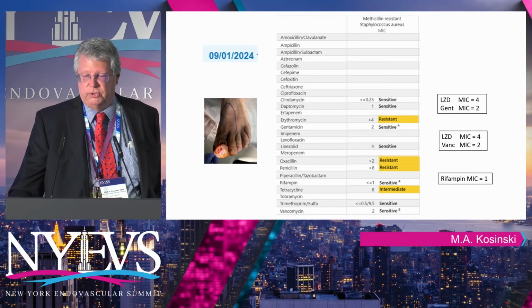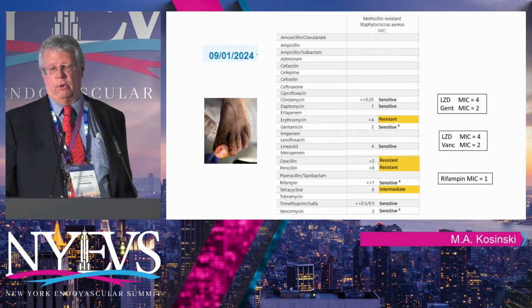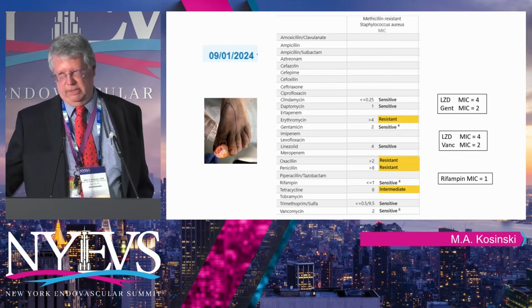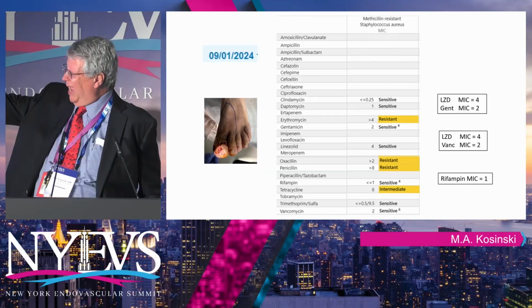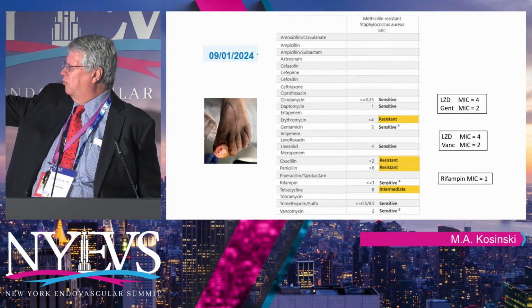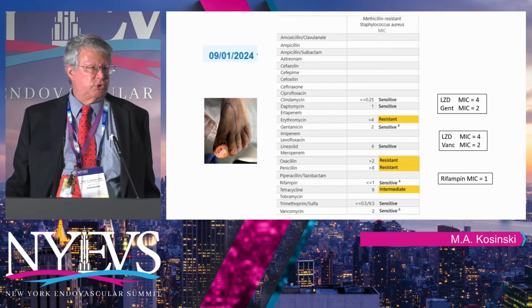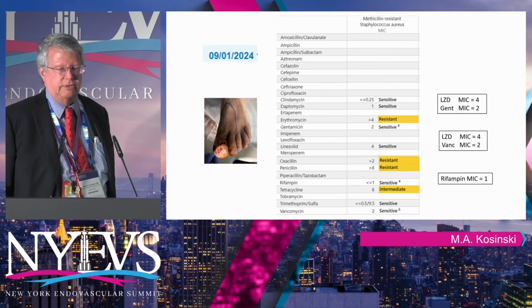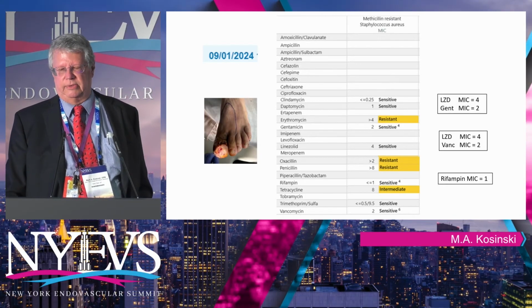Gentamicin has an MIC of 2. Linezolid has an MIC of 4. Maybe I should choose gent because it has a lower MIC. But if you take your thumb and put it over the MICs on the screen so that you can't read them, now the choice seems relatively clear, because gentamicin is ototoxic and nephrotoxic and linezolid isn't.